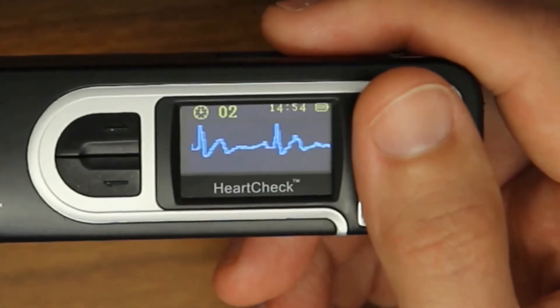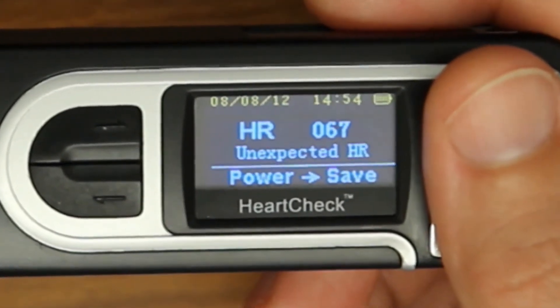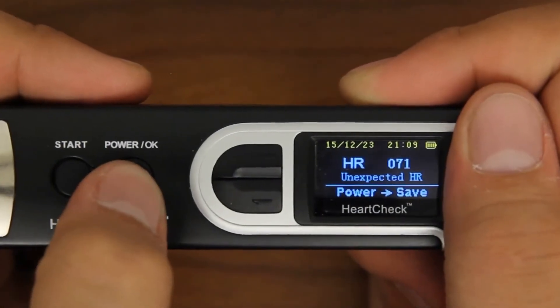Once the measurement is complete, the device will provide the heart rate and a basic analysis of the ECG reading. Select the OK button to save the results within the device.